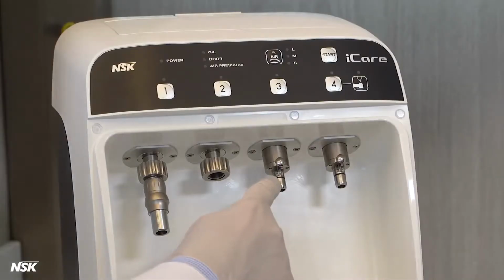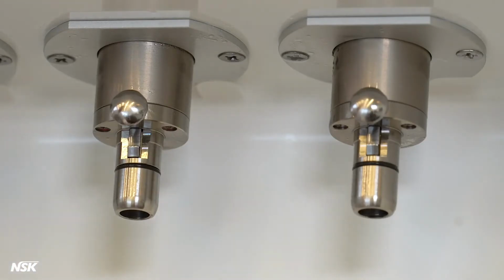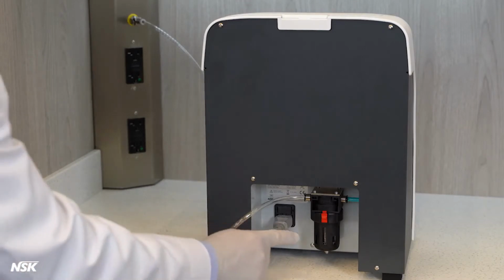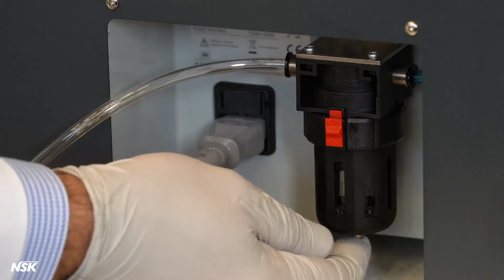If you notice your O-rings are starting to wear out, then replace with the extra set of O-rings in the original packaging. If water accumulates inside the filter cup at the back of the unit, press the drain button at the bottom of the filter to empty the air filter.